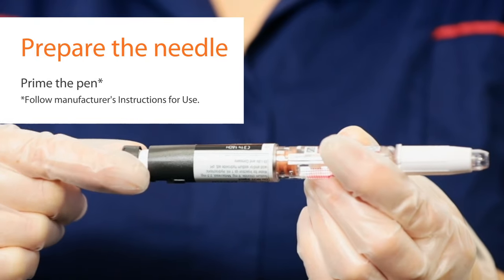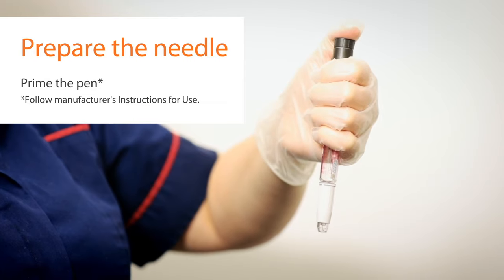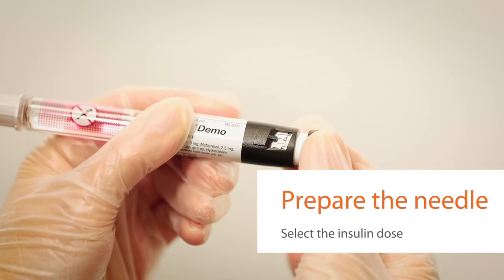Prime the pen according to the pen manufacturer's directions. Typically, this involves dispensing two units at a time until you see a drop of liquid at the needle tip. Remember to prime before every injection. With the pen ready, you can select the patient's insulin dose.